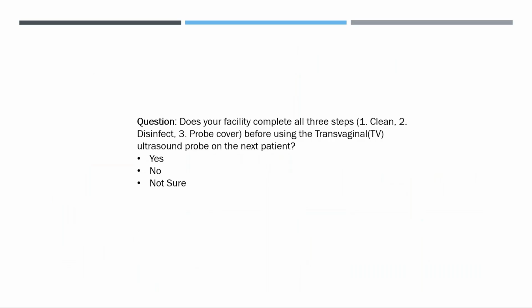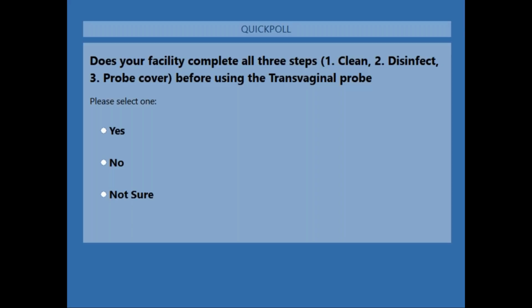So, next question. Does your facility complete all three steps? First, clean. Second, disinfect. And 3, use a probe cover after using a transvaginal probe on a patient before using it on the next patient. Please select between yes, no, and not sure.